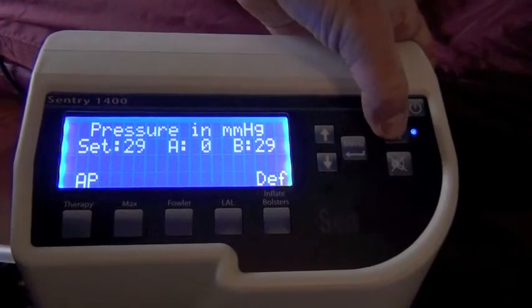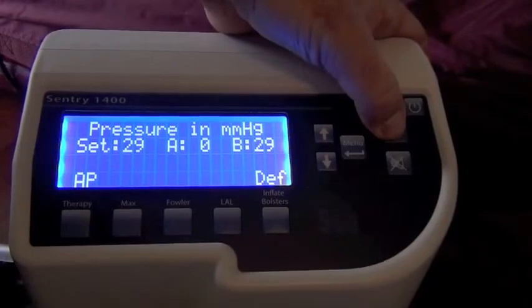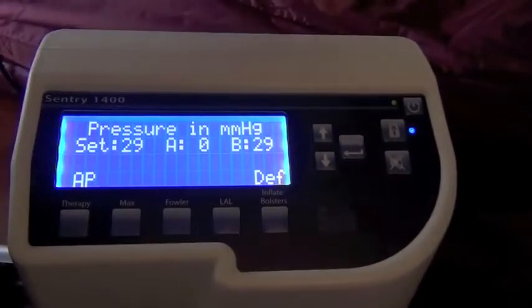And unlocking this is a pretty deliberate act. You have to hold that down again for a few seconds before it unlocks. So the chances of someone accidentally unlocking this are very remote.